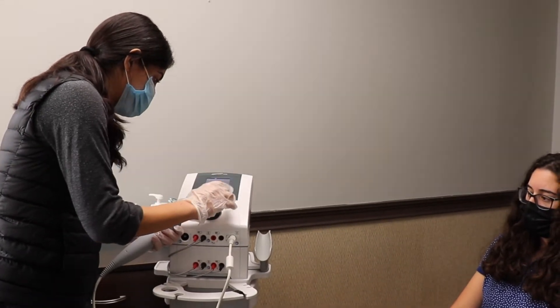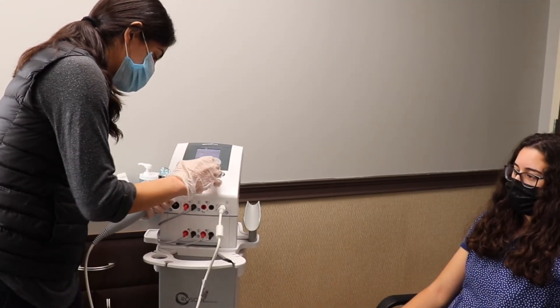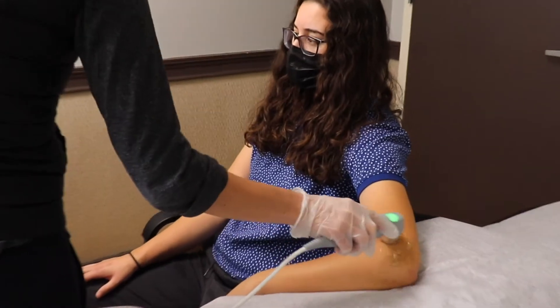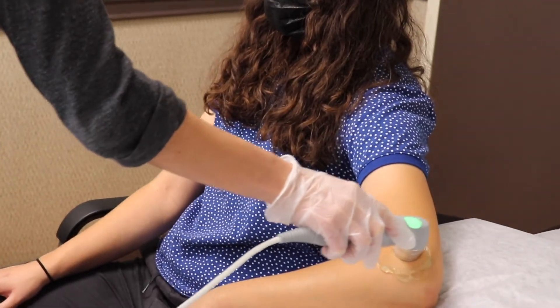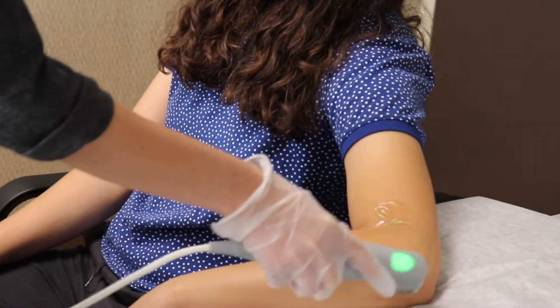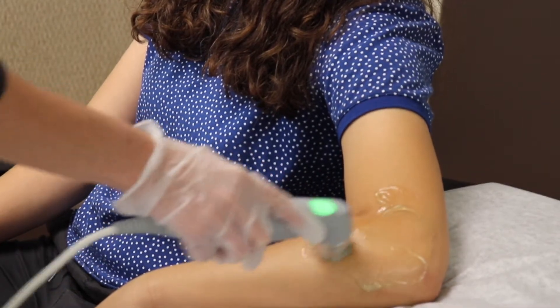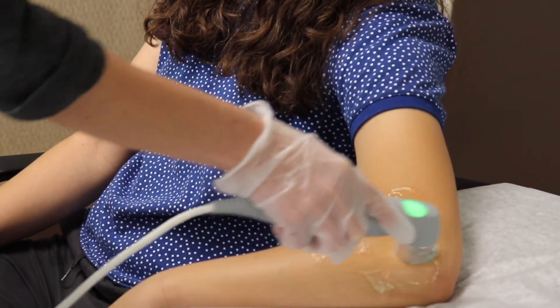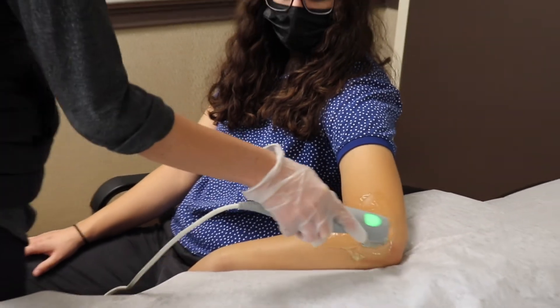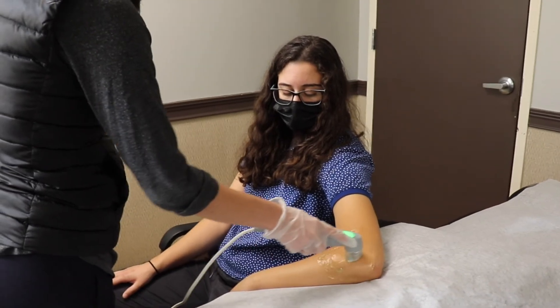I'm going to set this up for the thermal application and get this on there as I turn on the ultrasound. This is non-invasive — patients shouldn't really be feeling anything. If they start feeling a burning sensation they've got to let us know, and we either need to move it a little quicker or stop the application and turn off the machine. We generally just go around in a circular motion over the area of pain, and as mentioned, this helps with reducing chronic pain.